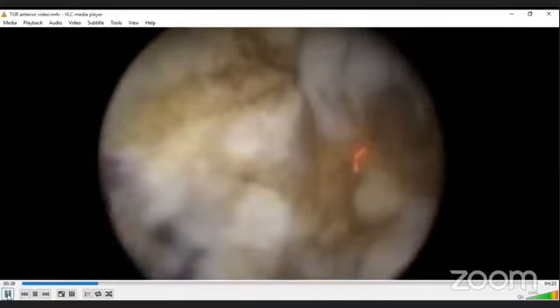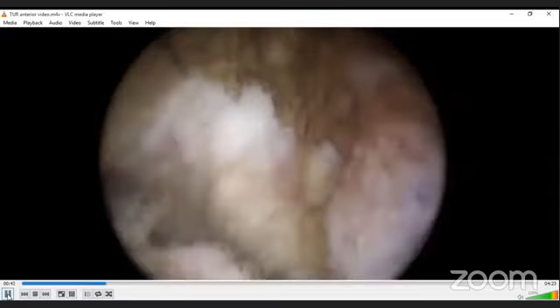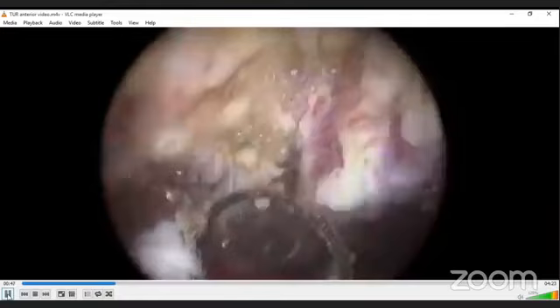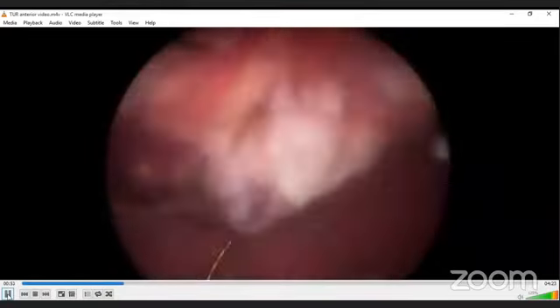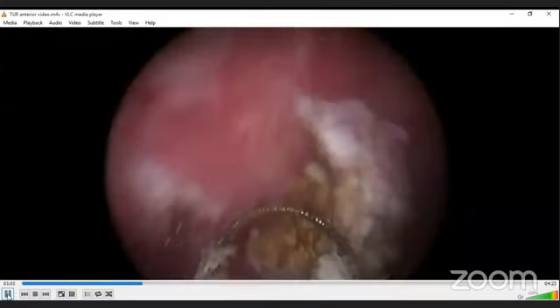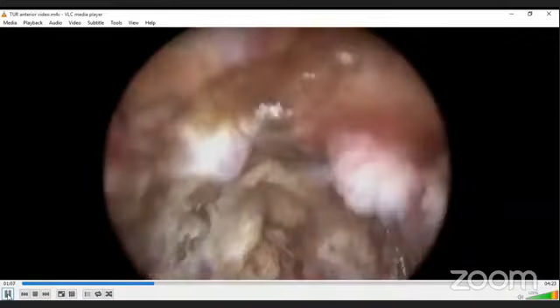In the beginning, as another speaker mentioned, we obviously need to do a very good survey of the urethra plus the bladder. And as you saw here, we saw this tumor and at a convenient position, or we start from the periphery where the tumor is less thick if the whole thing is solid. And if the tumor is totally papillary, then we can start it at a convenient area where we think we can come, usually near the peripheral wall, where we can come to the normal baseline bladder wall.